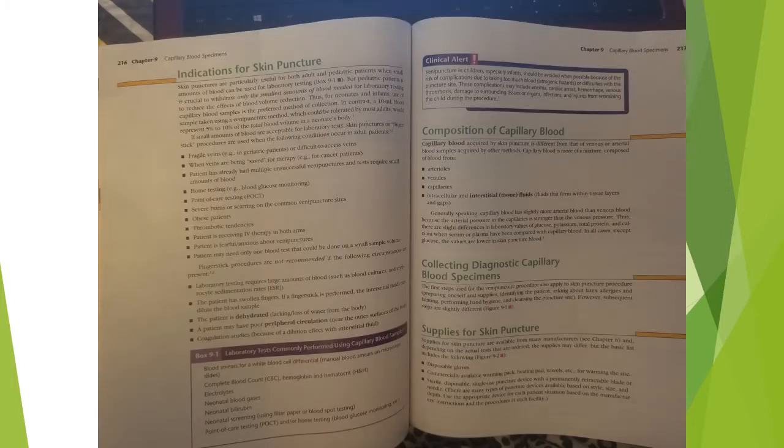Indications for skin puncture. Skin punctures are particularly useful for both adult and pediatric patients when small amounts of blood can be used for laboratory testing. For pediatric patients, it is crucial to withdraw only the smallest amounts of blood needed for laboratory testing to reduce the effects of blood volume reduction. Thus, for neonates and infants, use of capillary blood samples is the preferred method of collection.